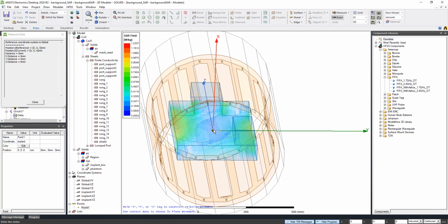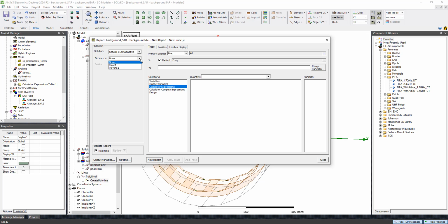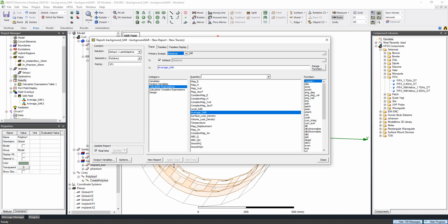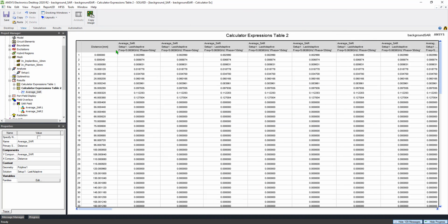So yes, I want to create a new model. I can draw a line. So let's say I draw a line along the axis. When I create the data table, I can choose the polyline that I just created, and then average SAR. So here I have the frequency, I have the phase. You can use all phases or just use one. Maybe all phases is too many. But yeah, so here you can see at different distances what the SAR value is, and at different frequencies with different phases.